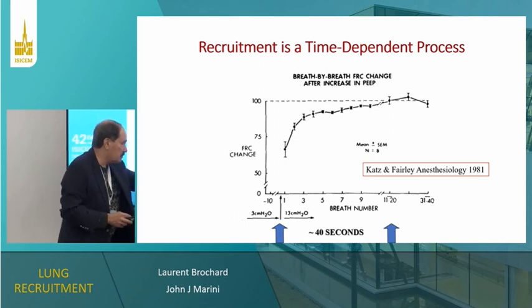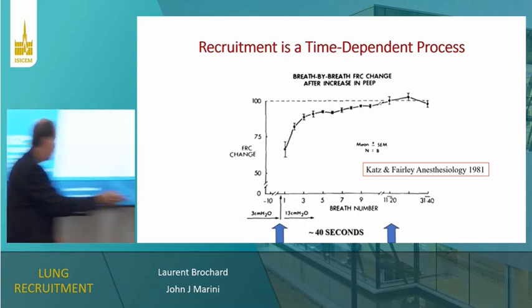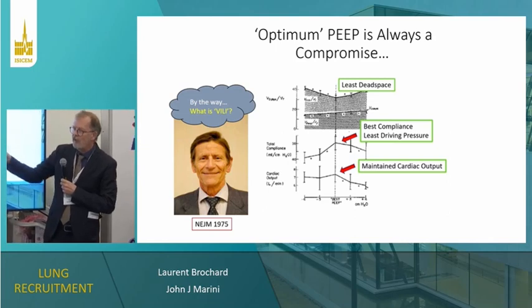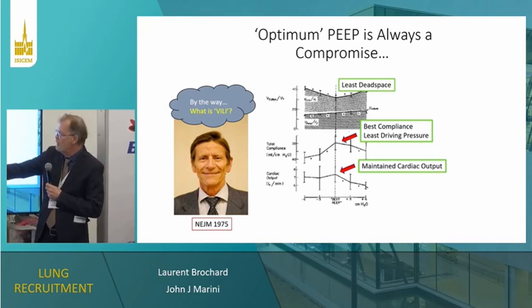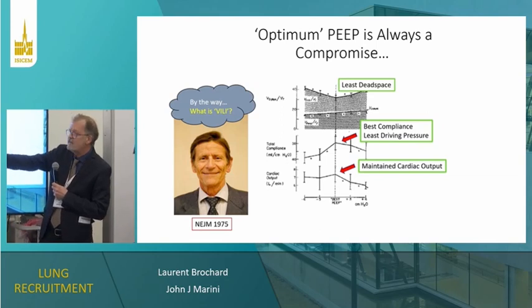Sure. Can we go back to the preceding slides? Oops, sorry. Yeah, just to be sure, we don't have oxygenation on this slide. What was really fascinating is that PEEP is increased, right, progressively. What do you think, this is the best PEEP.